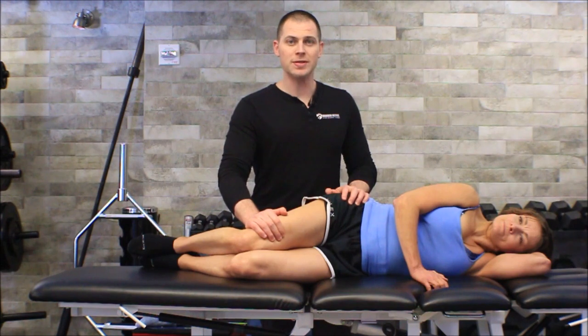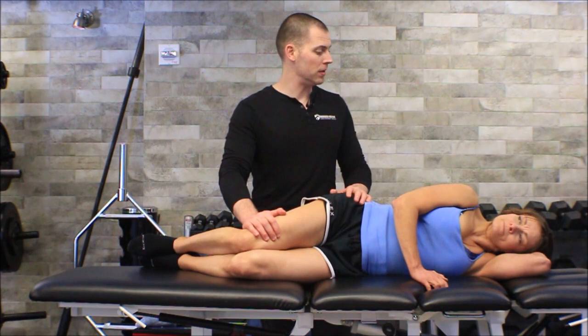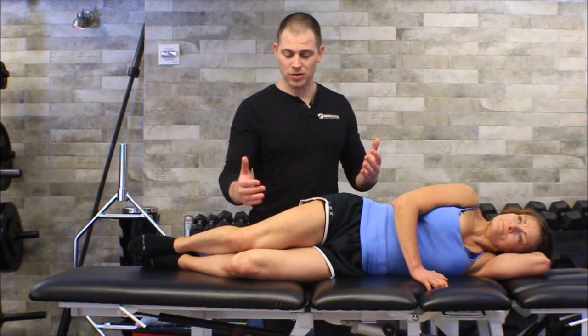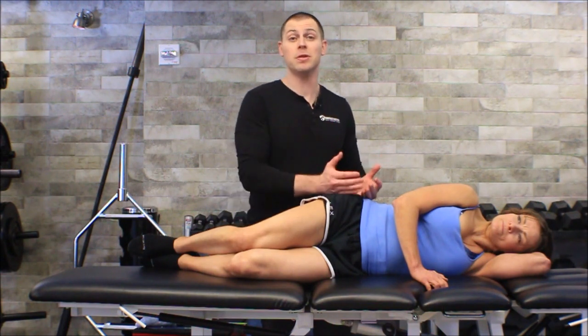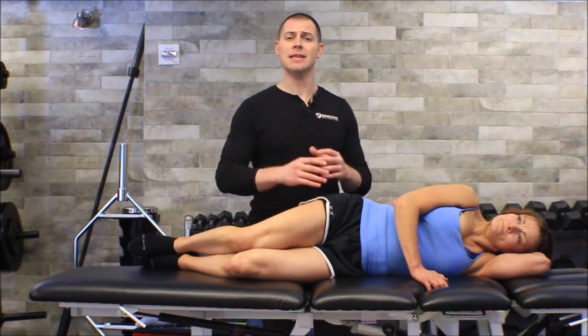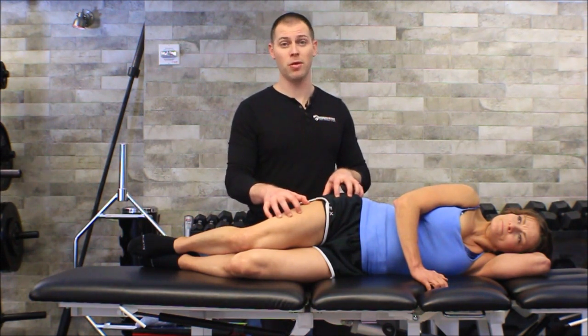Remember, when we're doing these techniques we are going after trying to change how individuals move. We want to improve the quality of movement, so this is going to be based on assessment. In this particular case I might do the lateral fasciolata if I saw a reduction in hip internal rotation, a reduction in knee mobility, or maybe knees bowing out on an overhead squat assessment — all good reasons to reassess after this technique.